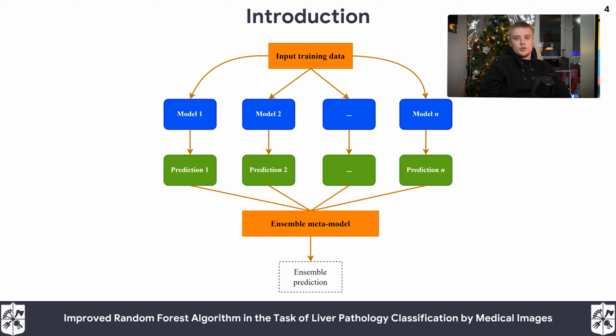There are also ensemble machine learning techniques that are promising for analysis because their approaches to creating and aggregating ensembles of models can suggest appropriate techniques for interpreting the solutions that emerge. In addition, ensemble learning algorithms are faster and more efficient than neural networks, which is beneficial for clinical specialists while creating medical decision support systems. Thus, this study aimed to develop an ensemble learning algorithm that can demonstrate the best results in the task of normal pathology classification based on medical images.